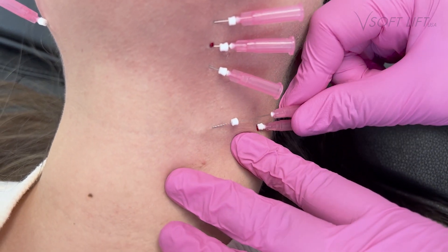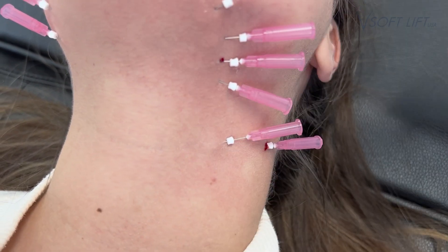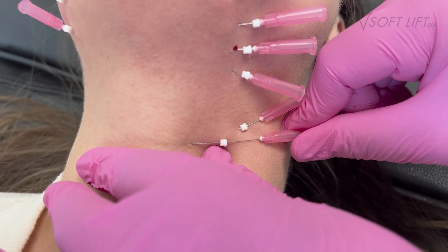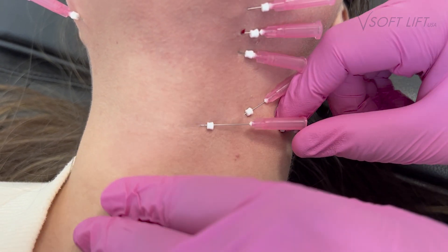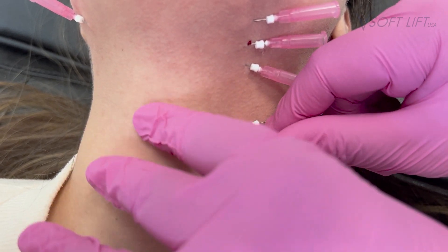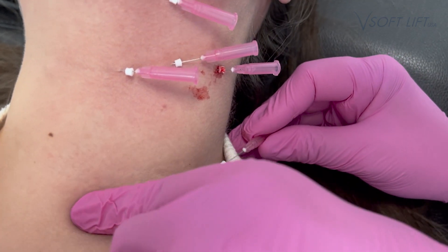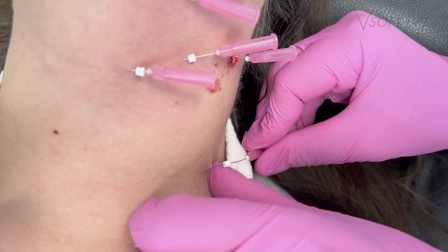I reserve these for cases that are either very severe or for patients who are really looking for a dramatic result. Otherwise, your monothreads are a great go-to as well. That is why I have chosen this thread today — this patient is really, really motivated to try and tighten those areas.